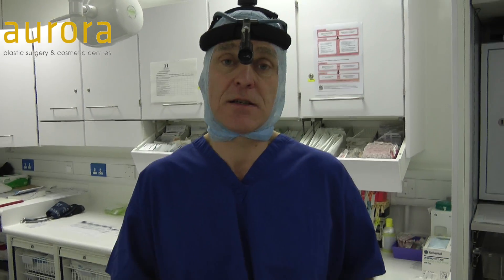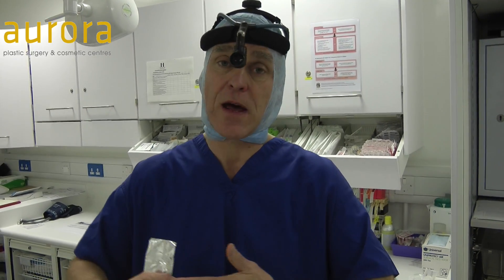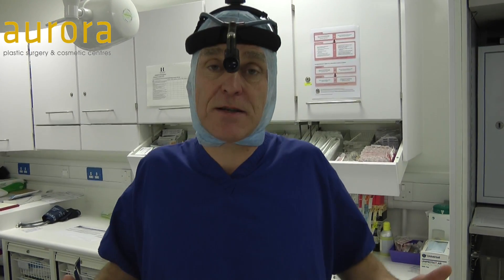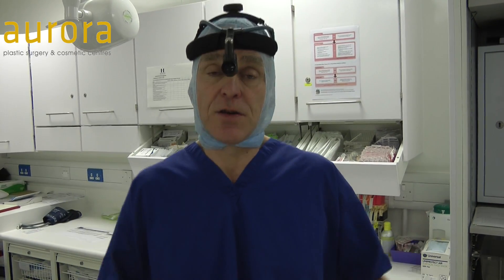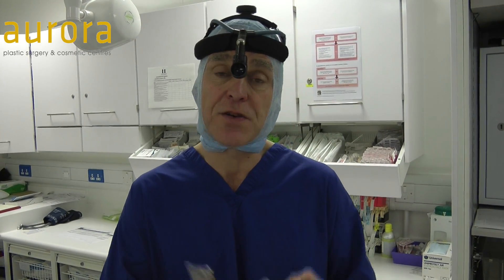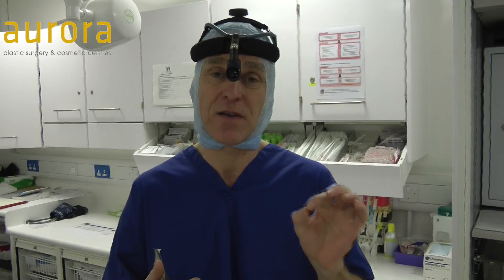We're using these stitches more and more — they're called barbed stitches. When you put them through the skin, they go through but you can't pull them the other way. It's great for a plastic surgeon because it means we can bury the stitches and we don't need so many knots. Knots are a potential problem because if a knot gets exposed to the outside elements, the air will cause a minor inflammation in the wound.